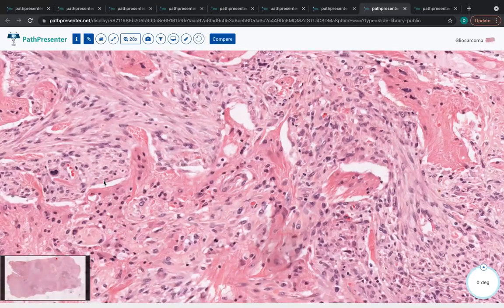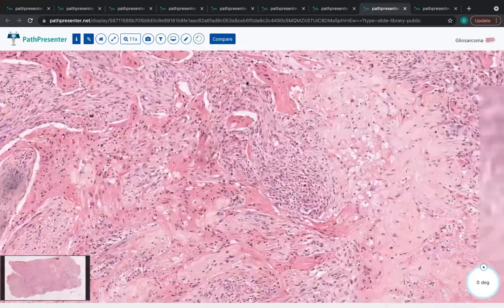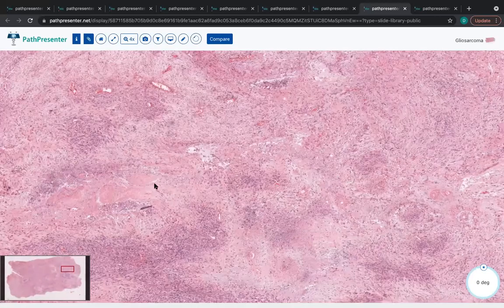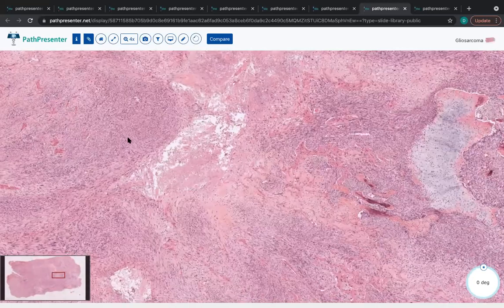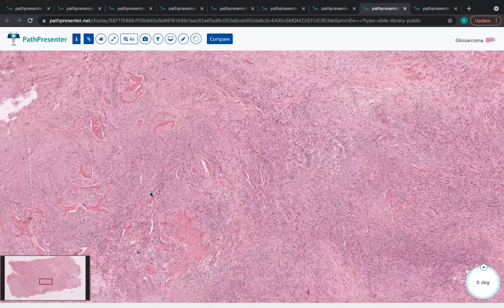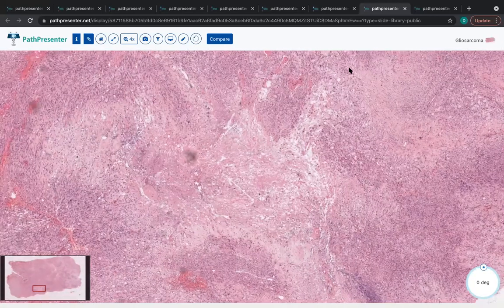You usually will not have difficulty finding mitotic figures, such as there's one right there. And I think this one also had some large regions of necrosis. The abnormal vessels in these tumors will usually be confined to the glial component if one is able to find those, but usually the other high grade features will not be difficult to find. Okay, thank you. Of course.